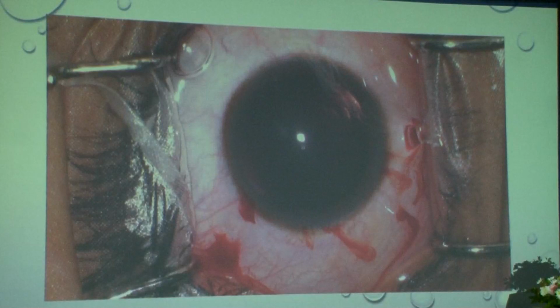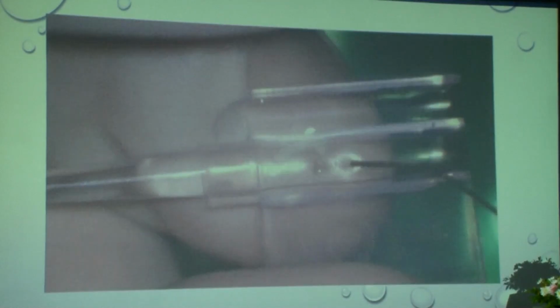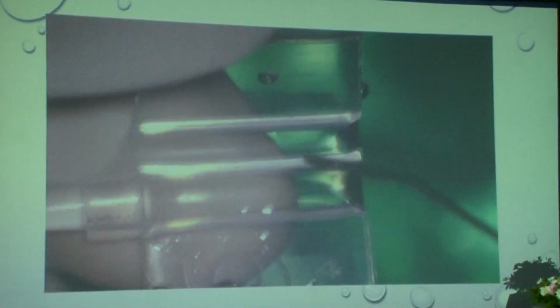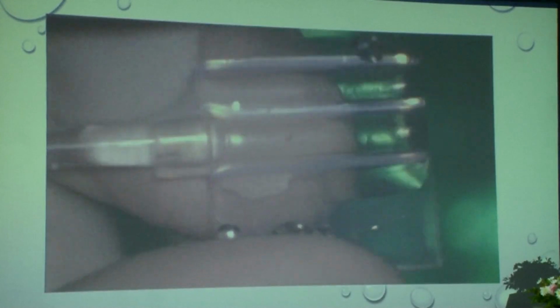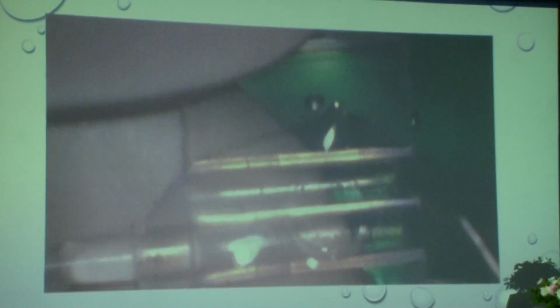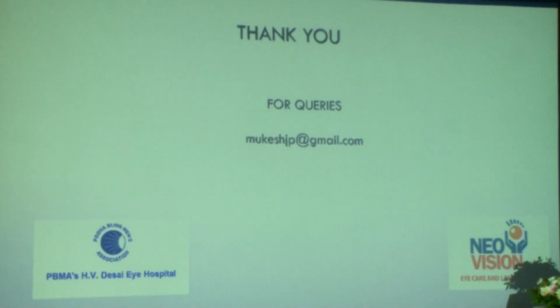I think I have time to show this, so I will show this video. This is again just the loading of the IPCL. I use only BSS for loading here. I don't use much visco now. This was the old video where I used viscoelastic, but now I almost just do it under BSS as per the company recommendation guidelines. I think Ridhima, you have already shown this. I'll skip this. This is IPCL only. So I think that's it from my side.